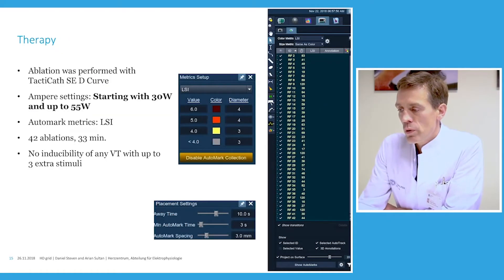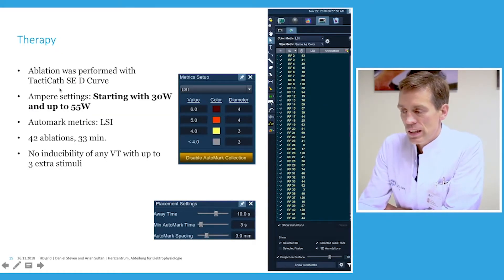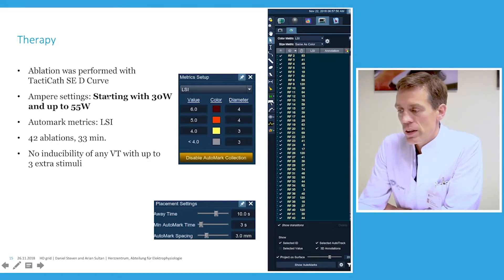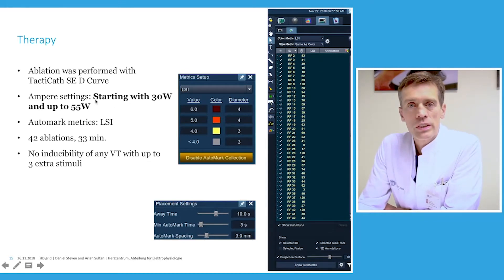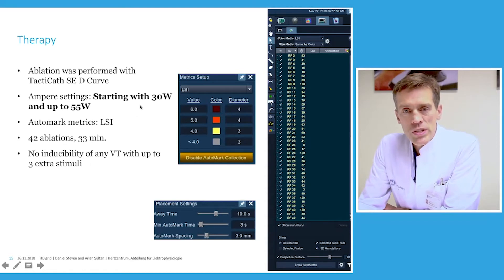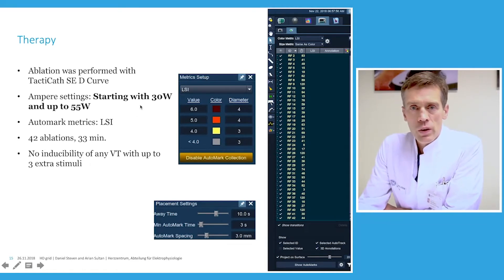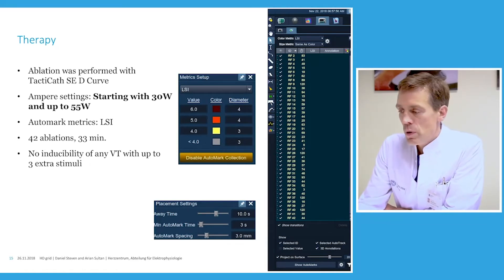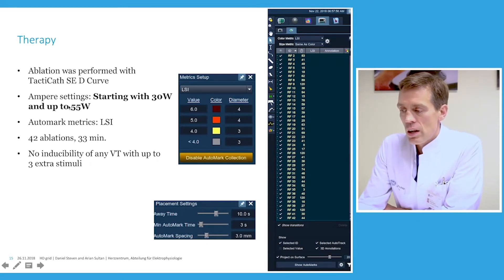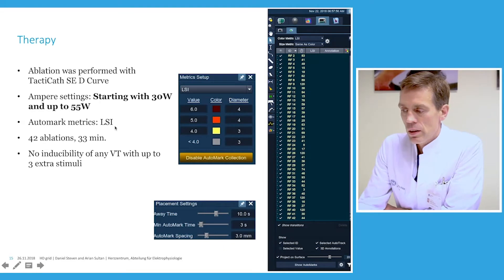For therapy, ablation was performed during tachycardia with a D-curve catheter, with the generator starting at 30 watts. When we see a nice impedance drop and no steam pops, we ramp the energy up to 55 watts. This is the automark metrics using LSI.